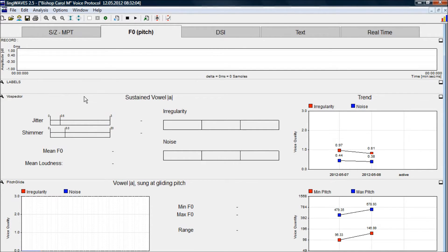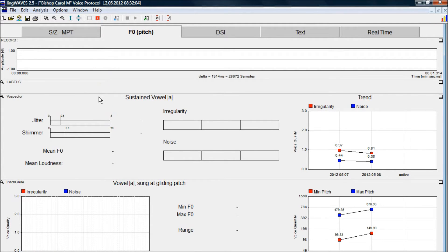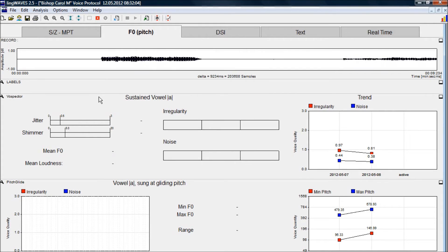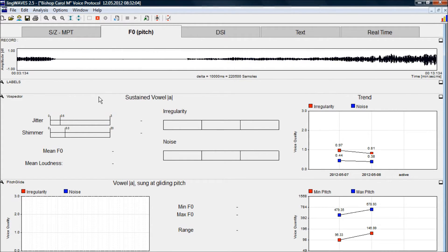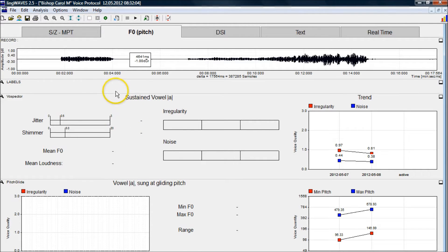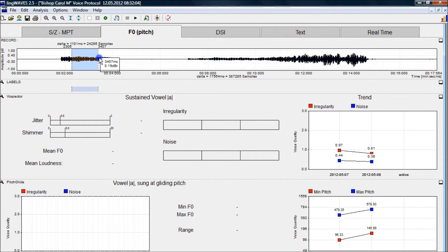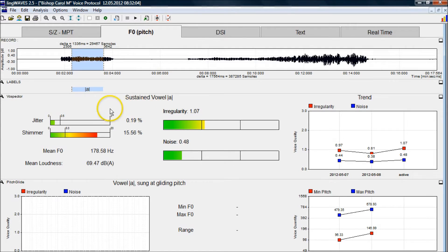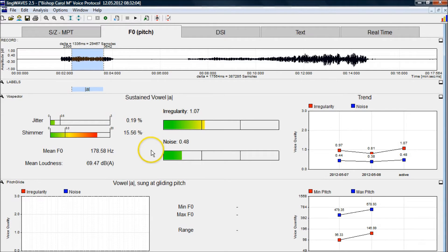Now we're going to record a phonation. For this one we just select two seconds of that and label it with the R symbol. It measures your voice quality — it shows irregularity, which corresponds to roughness in your voice, and it shows noise, which corresponds to breathiness in your voice. It also gives jitter and shimmer measurements.